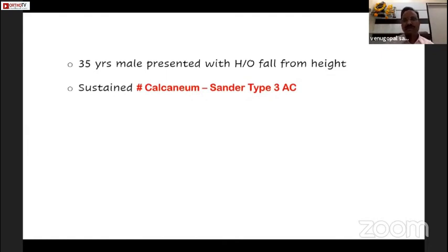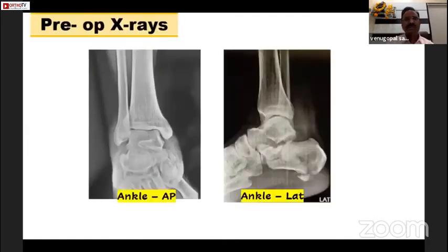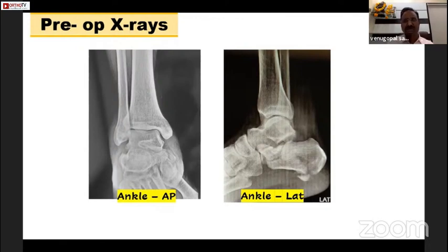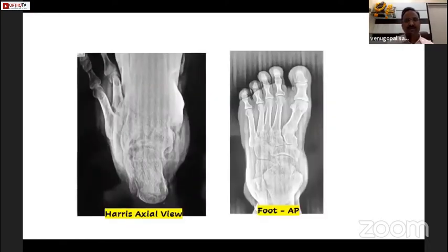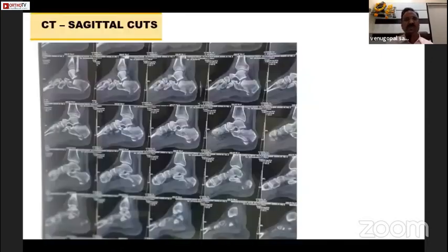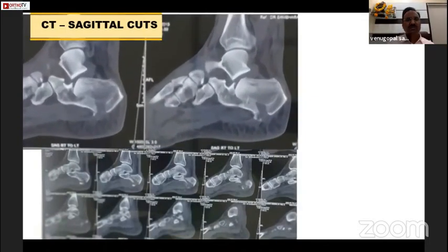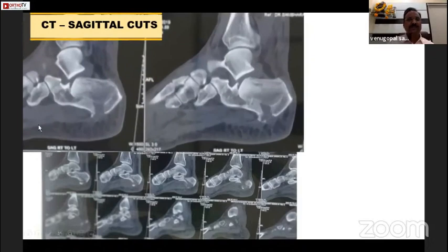These are his pre-operative X-rays. In the lateral view, we can almost see the posterior facet has gone down and is almost vertical — the articular surface is nearly vertical and there are secondary fracture lines. The Harris axial view shows widening of the calcaneum and also some varus. The foot AP view and CT sagittal cuts show the posterior facet lying almost vertically.